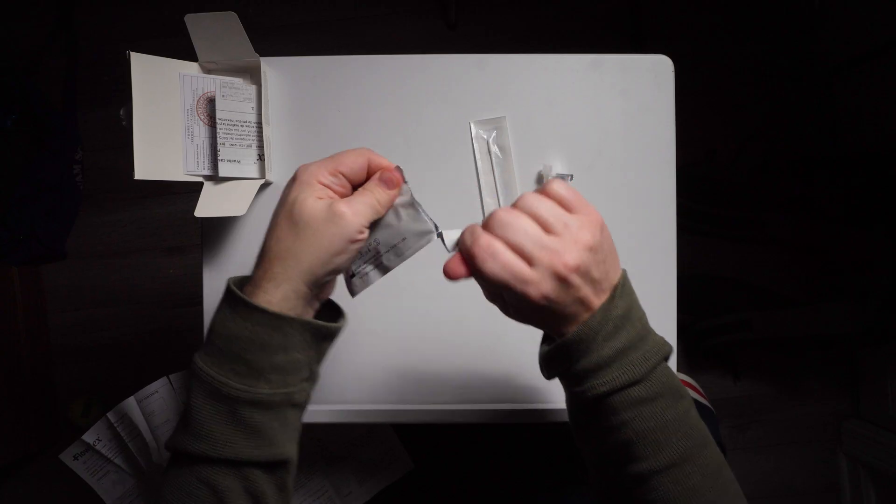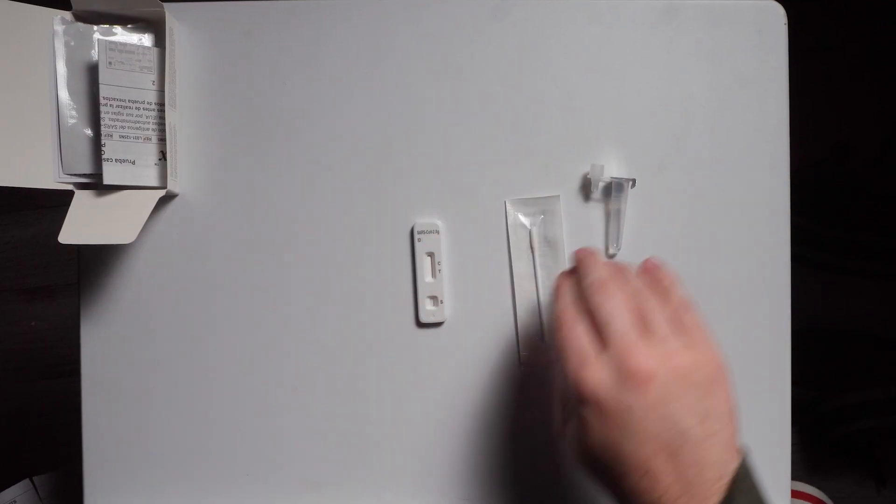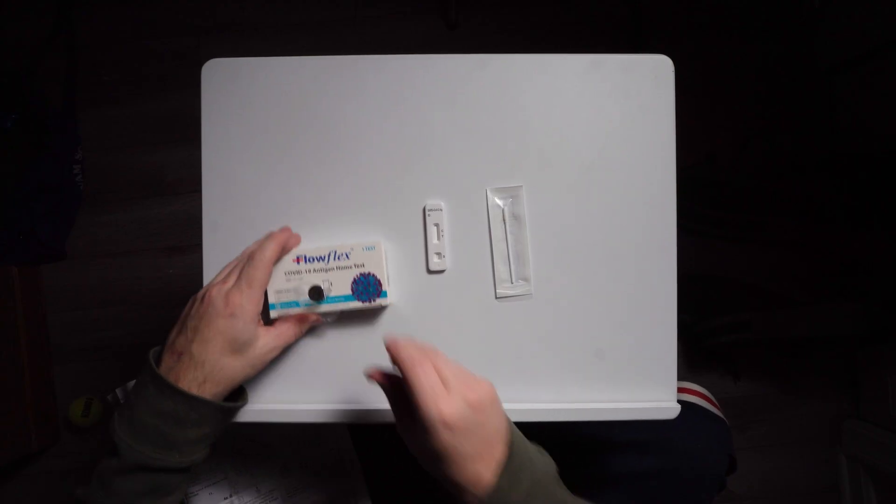The first thing we're going to do is locate the pouch. There's my test strip, and this is all this test really has. Let's put that in there.